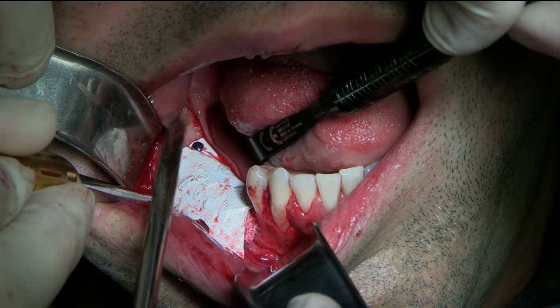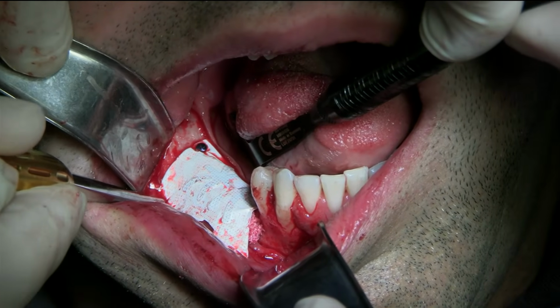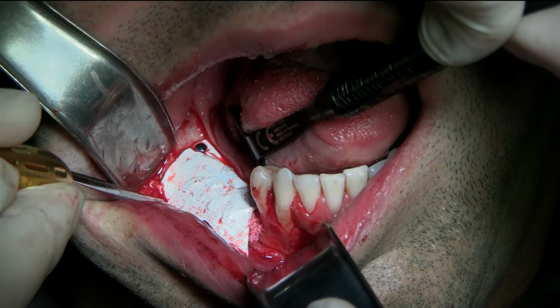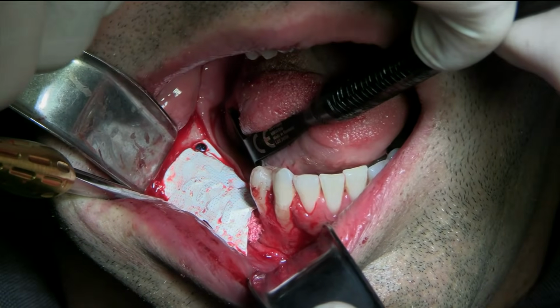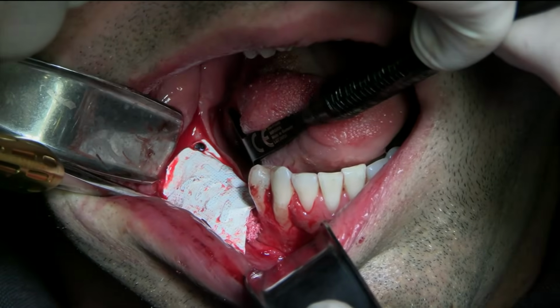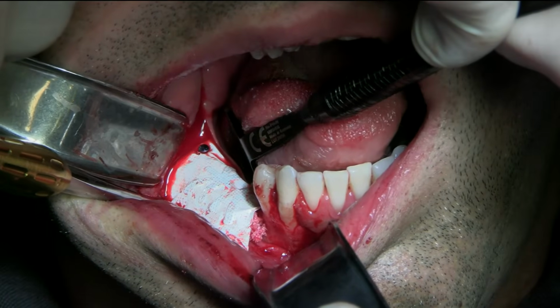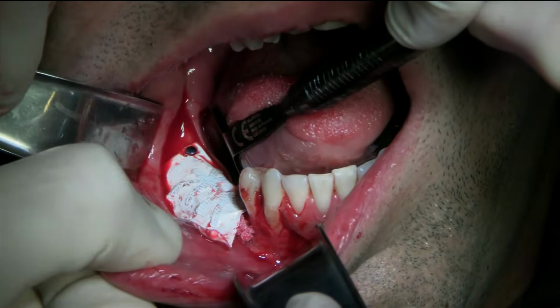Suction it. Okay, so I have to do it. So you have to hold this one. Hand down. Tapping. You're going to get some tacking. A little bit more, Dr. J. Okay, got it.